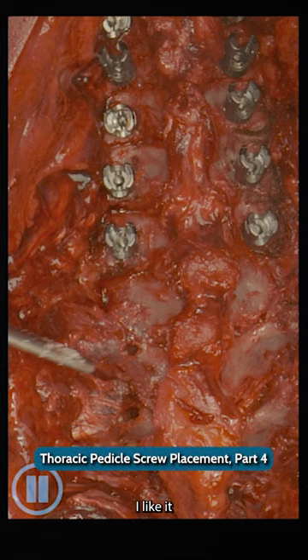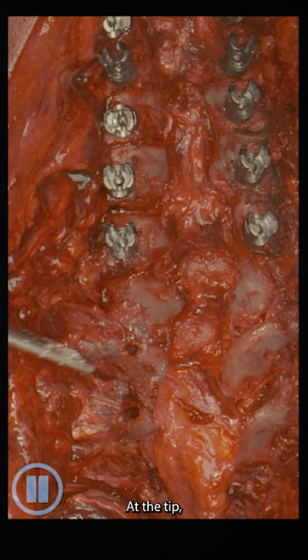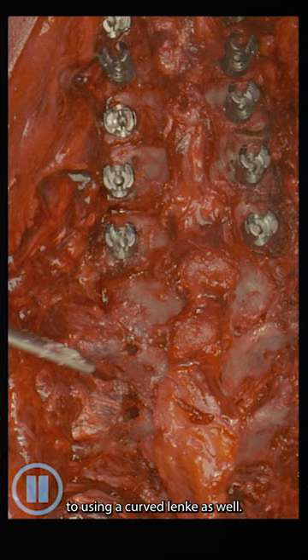I tend to use a Lenke probe. I like it more in terms of its geometry and its sharpness at the tip. I tend to use a straight Lenke, but not everybody does that. There's some value to using a curved Lenke as well.